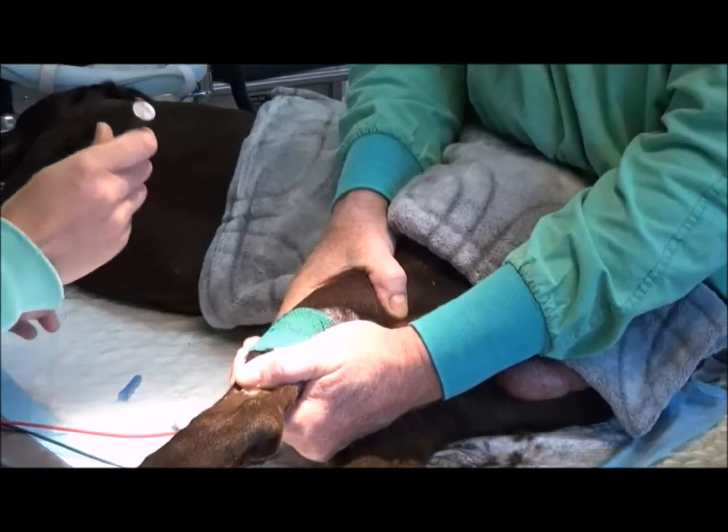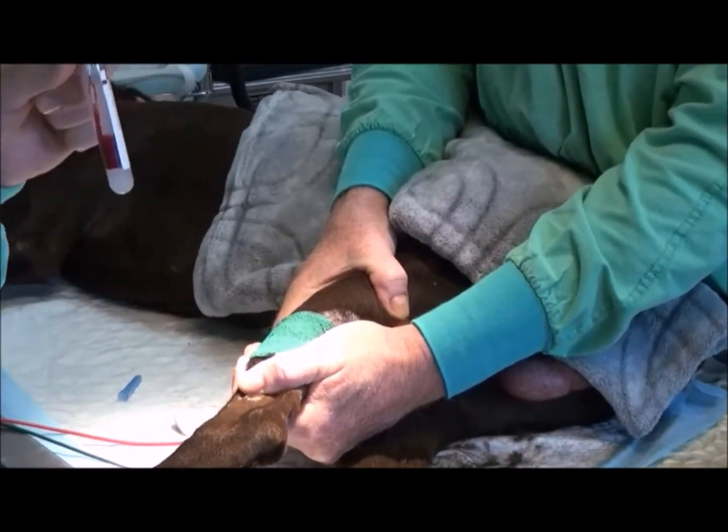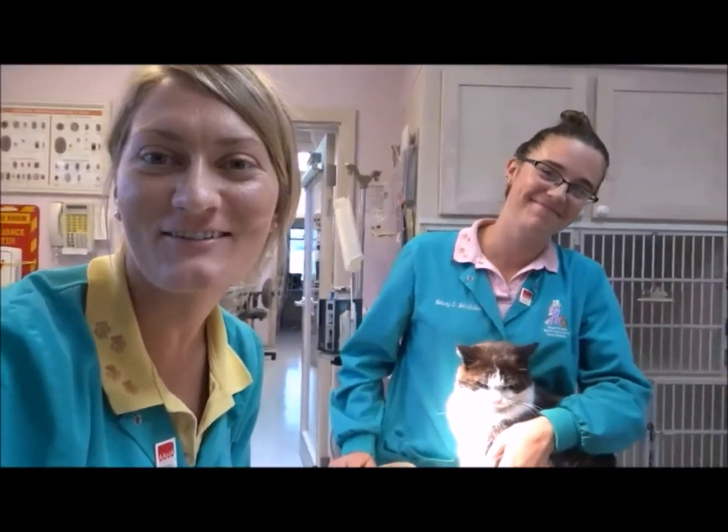Thank you. Okay, and we're good. I'm going to get a blood sample from the cephalic vein of our feline patient.